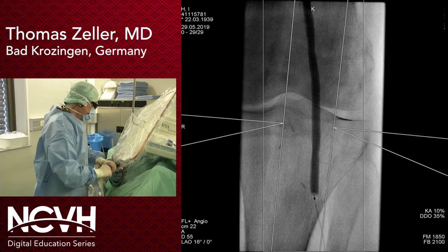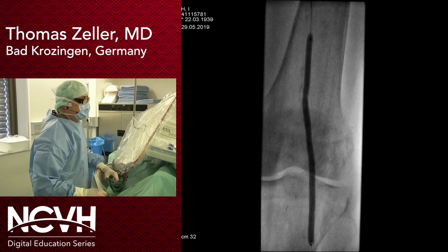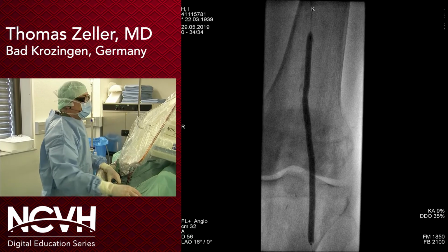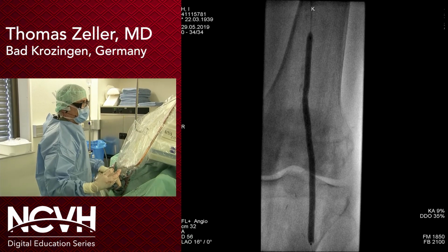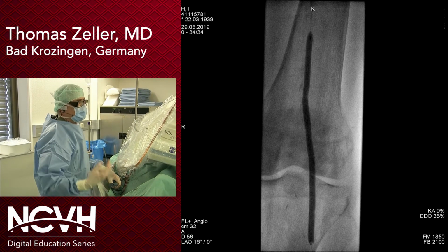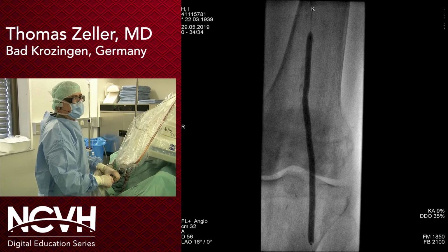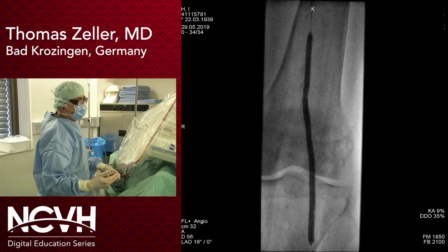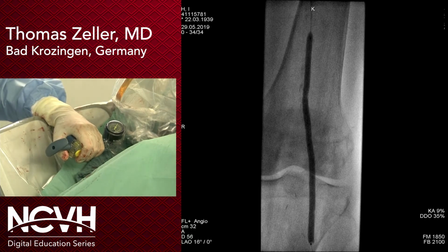You may be aware of the first-in-man outcome of the Illuminate studies. There had been two phases of a single-arm study. One phase of 50 patients did perform drug-coated balloon angioplasty without pre-dilatation. Another 50 patients had been treated with DCB following pre-dilatation. And between both cohorts that had not been randomized, there had been no difference in terms of patency up to 2 years. So we don't know whether pre-dilatation is really essential for improving the drug uptake.